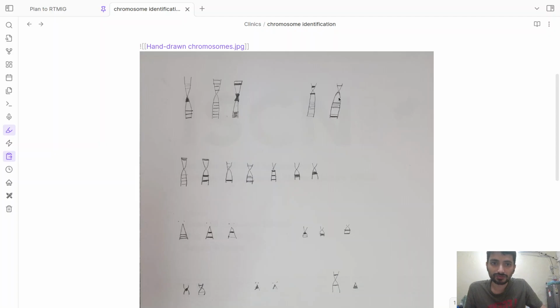And chromosome 5 is actually similarly sized, and this has a slightly distal dark band, which might be a single box-like band, or it might be a group of multiple dark bands, depending on the length of the chromosomes when they were stained, right? So these are the first five chromosomes.